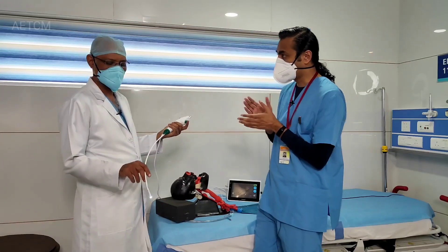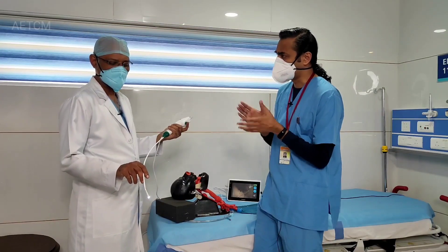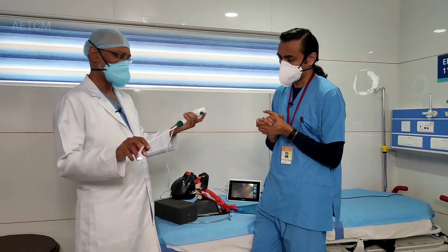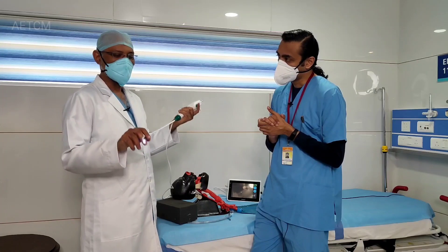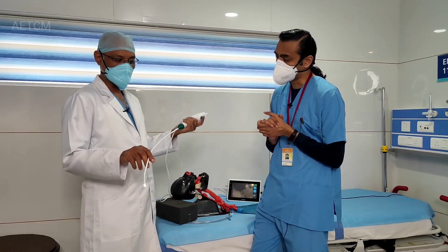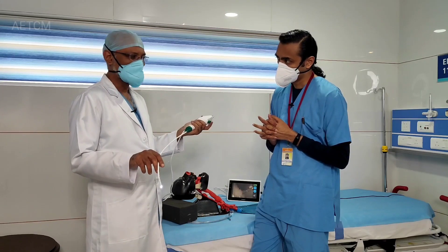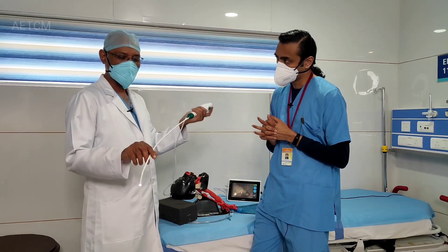Can you explain how this equipment can help in a difficult intubation scenario? This is not equipment for an emergency intubation — that's something you should understand. Because to organize it and intubate takes a lot of time and you might lose valuable time. But in the anticipated difficult airway, you can use it as a planned technique.